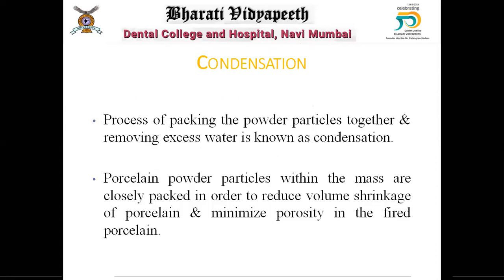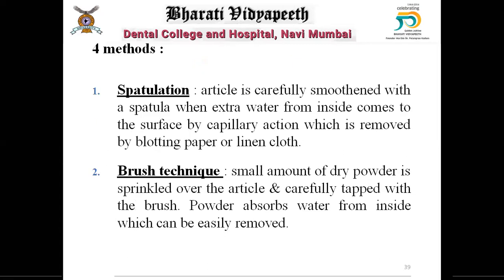Now the next stage is the process of condensation. Once you have mixed and applied, the excess water has to be removed. So it has to be tapped with specialized instruments, and the excess water has to be removed, because the more the water, the more will be the shrinkage in the final product and the more will be the porosity during the firing. Condensation is done using four methods.